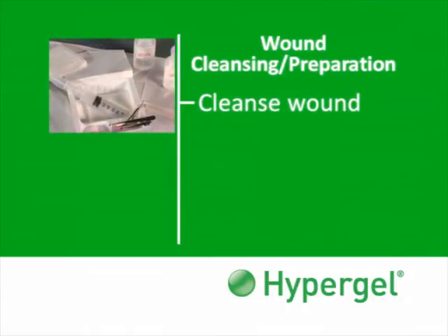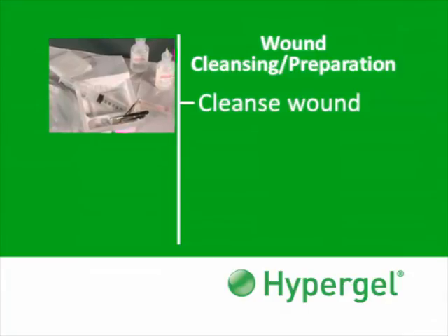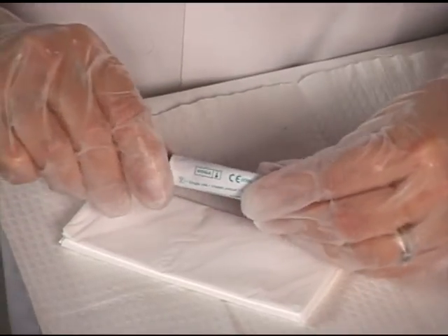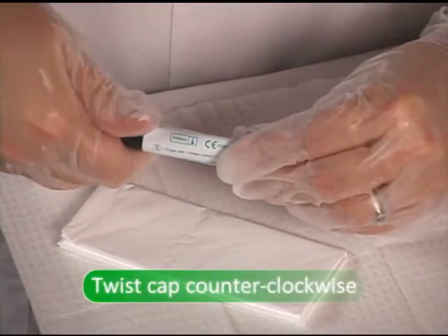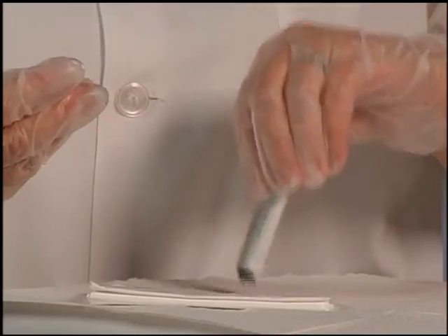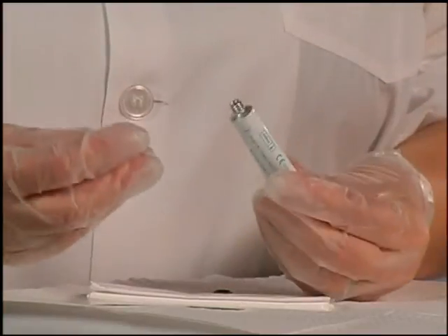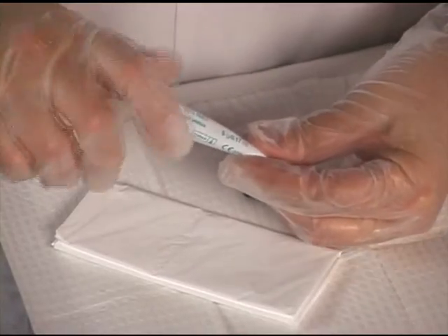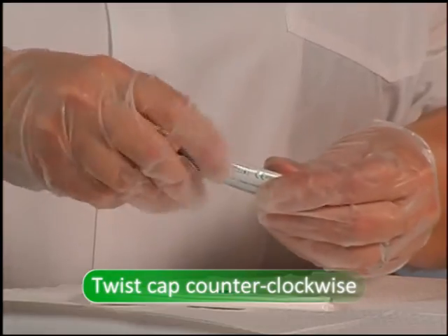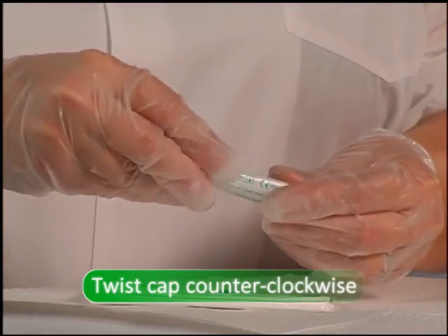To use Hypergel, first cleanse the wound and peri-wound area and pat dry. Open the Hypergel tube by first gently twisting the cap in a counter-clockwise direction to release the inner ring. Then invert the tube to allow the inner ring to fall away. Then reapply the cap to puncture the sterile seal on the top of the tube. Turn counter-clockwise to remove the cap.